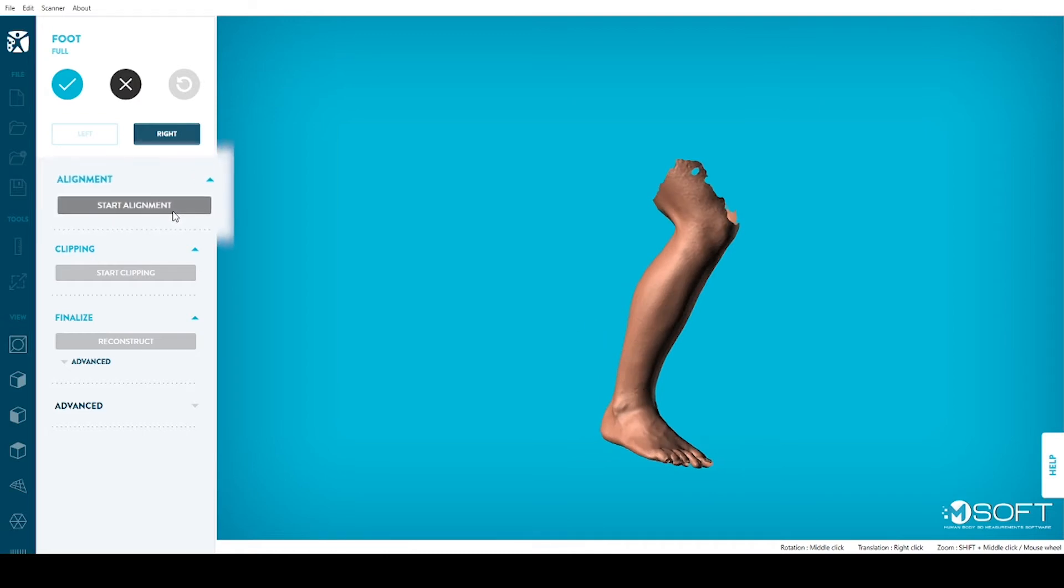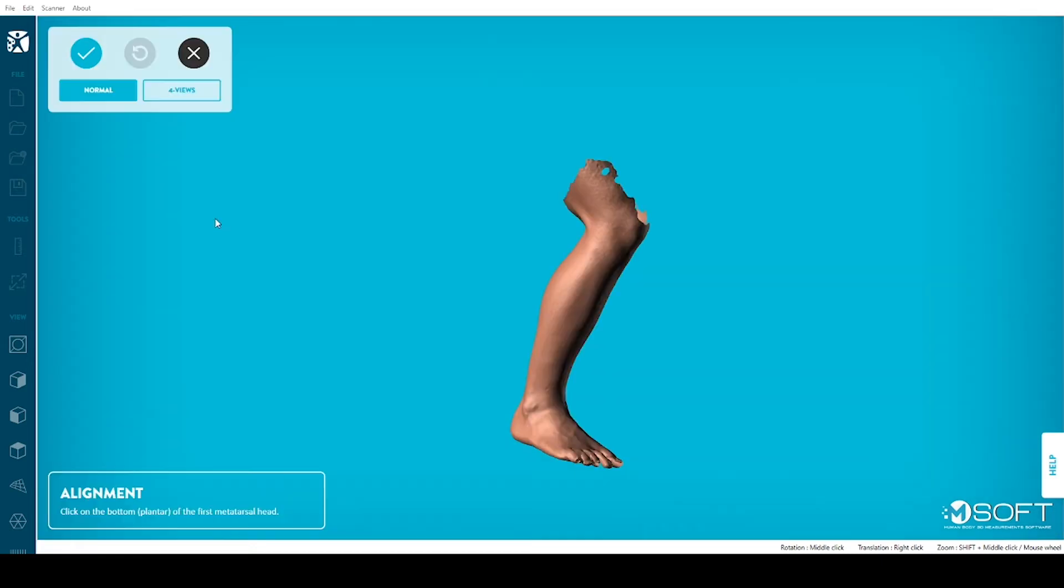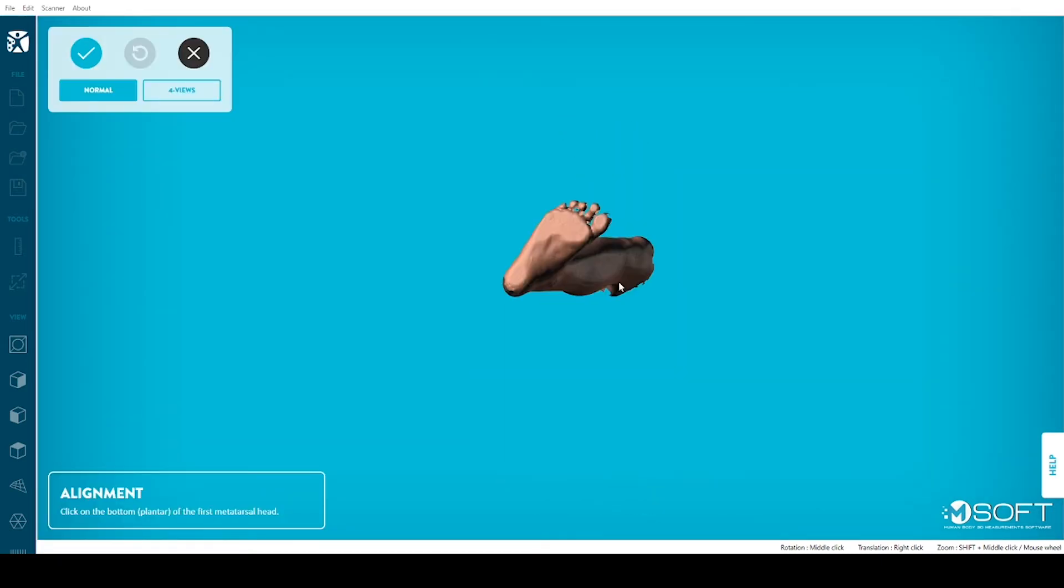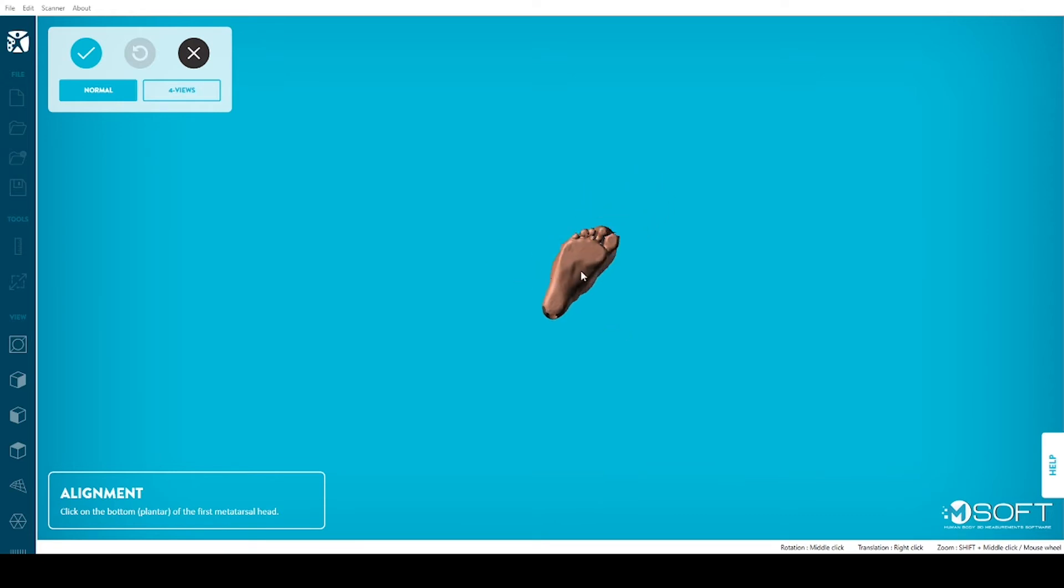Aligning your scan will indicate to M-Soft where are the toes, the heel, and the floor. Adjust the view by following the instructions at the bottom right corner of your screen to view the plantar surface appearing.